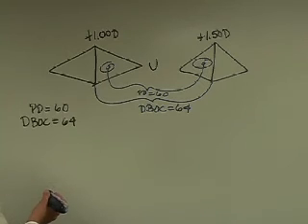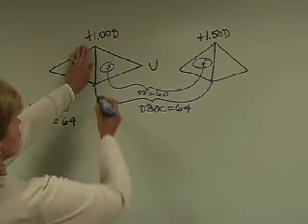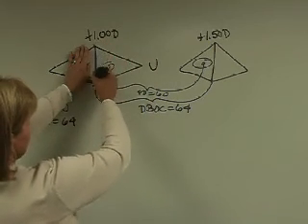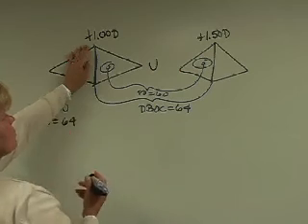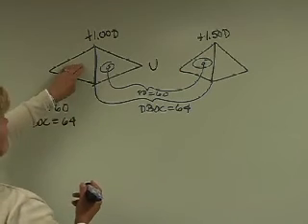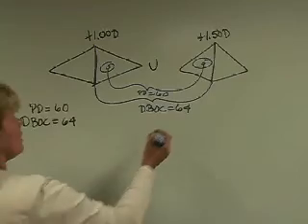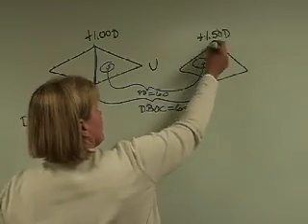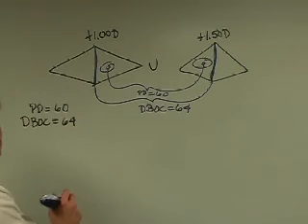Already we know that any prism induced in here, we know the base direction. The patient's only looking through this part of the lens when they're looking straight ahead. And here's the base, and that's pointed out towards the nose. If the patient was looking in this side of the lens, it would be base in prism, but in this case it's base out. And it's base out in both eyes. And that's typically what you'll have. You do have to be careful if you have a plus lens in one eye and a minus lens in the other. Chances are you will have unequal base directions.